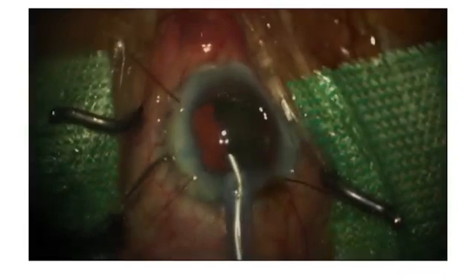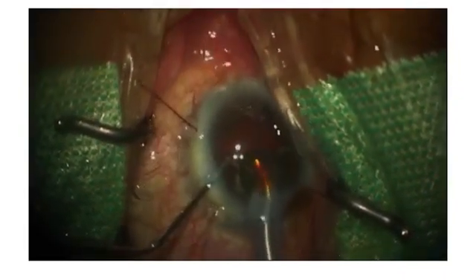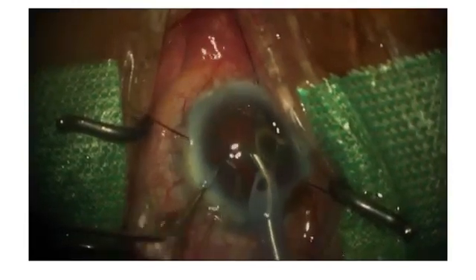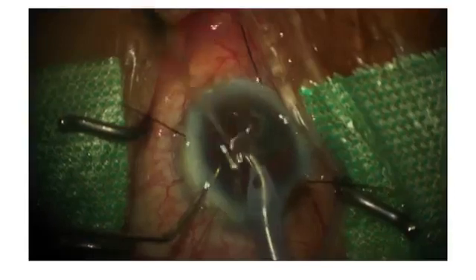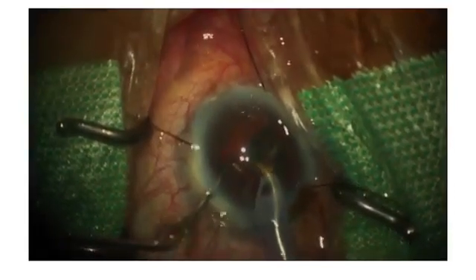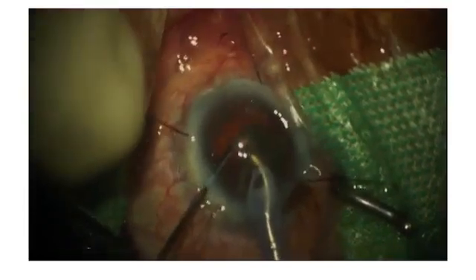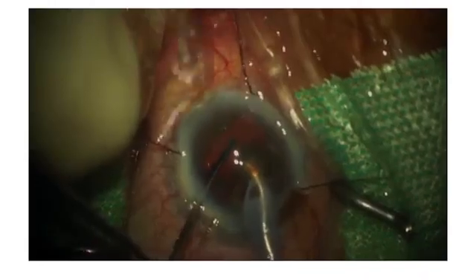The posterior capsule can come to the phaco tip and cause damage to the posterior capsule. This video shows you the second instrument to prevent the posterior capsule from coming to the phaco tip. After this, you may need to use viscoelastic to open the back, and put the CTR in, and put the lens in the back.